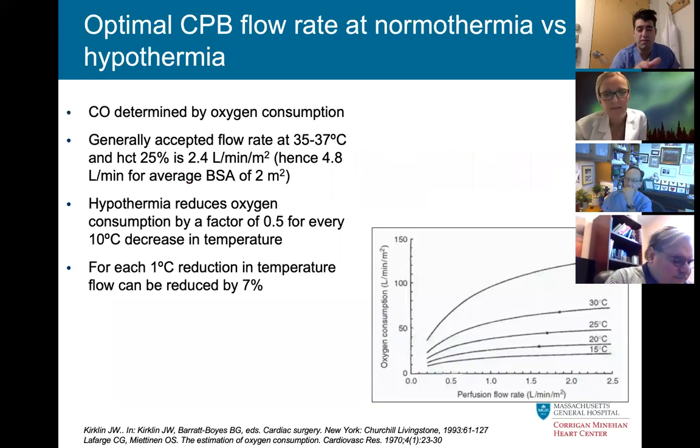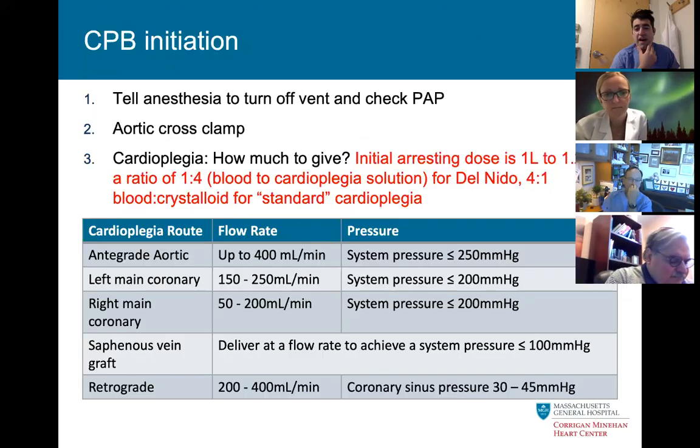Antonia, one other point about number 1 there, you said that when you have adequate flows, you can turn the lungs off. It's not just adequate flows, but you also have to make sure that the patient's not ejecting anymore. Because if they are still ejecting a lot and the lungs are off, then you have a shunt and the patient will become hypoxic.